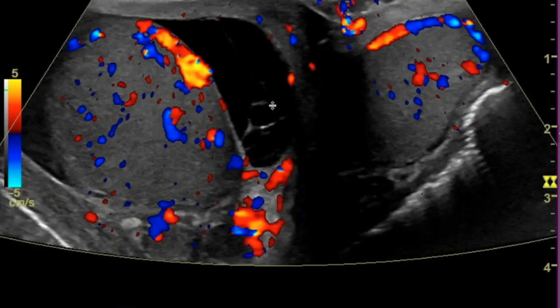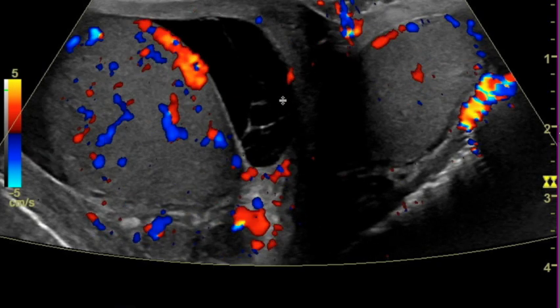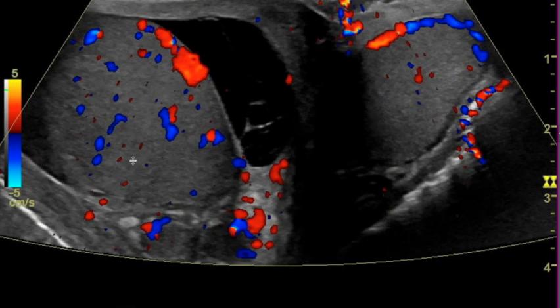Just to orient you here, we have the right testicle. This is a midline view. I have a little bit of the left side as well. As I scroll, we see that there's flow to the right testicle. I'm mainly going to focus our discussion on the right since that was the area of clinical concern.